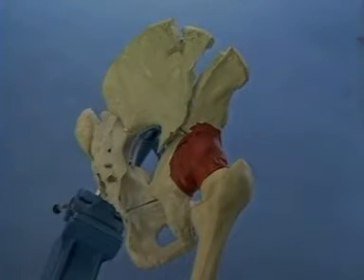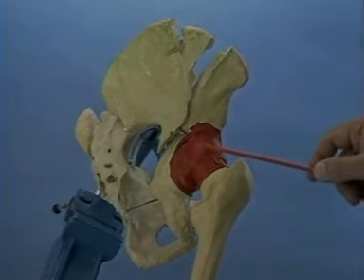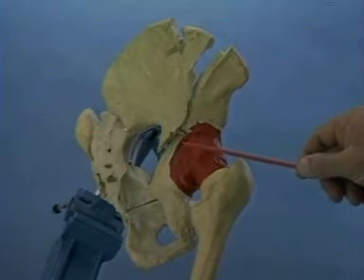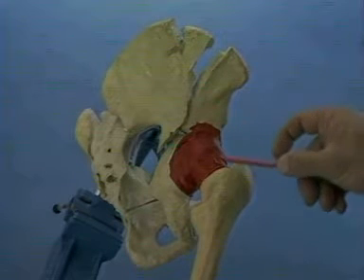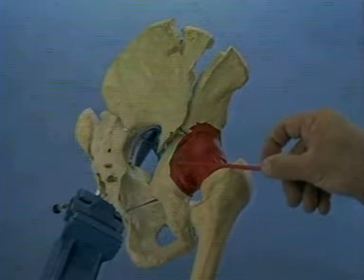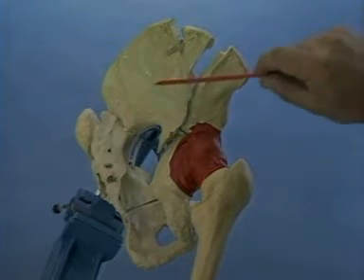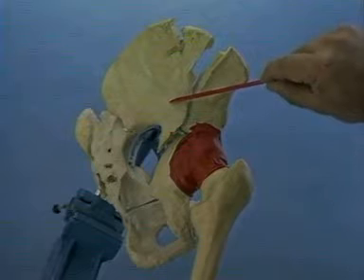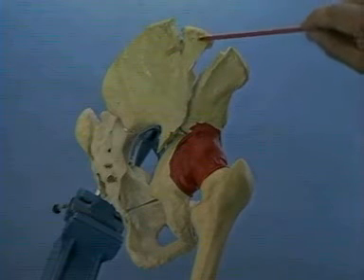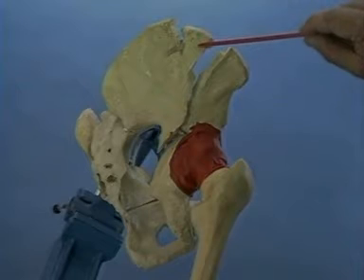Shown is a both-column fracture of the acetabulum. The anterior and the posterior column are completely separated from the intact portion of the ilium. No portion of the articular cartilage remains attached to the intact portion of the ilium. There is a triangular segment of the ilium which is found at the iliac crest.